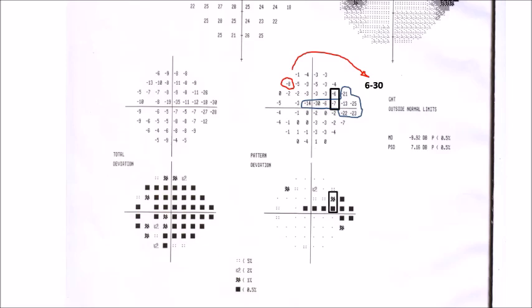So the point is the meaning of these dots: these points are abnormal, but they can be normal in 5%, in 2%, in 1%, in 0.5%. But this does not mean this one is surely more depressed than the other one. Most probably the darker should be more depressed, but this depends on the location. The only fixed rule about the meaning of these dots is the probability of being abnormal: 5%, 2%, 1%, 0.5%.